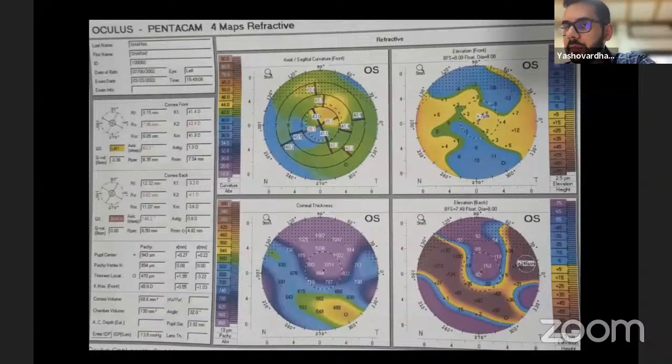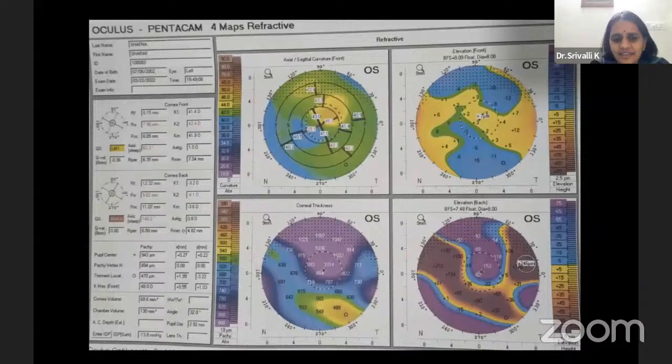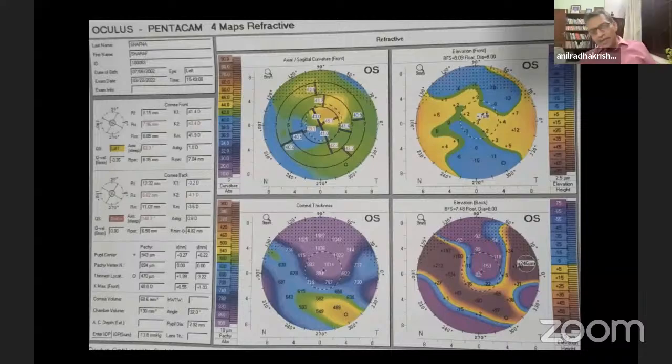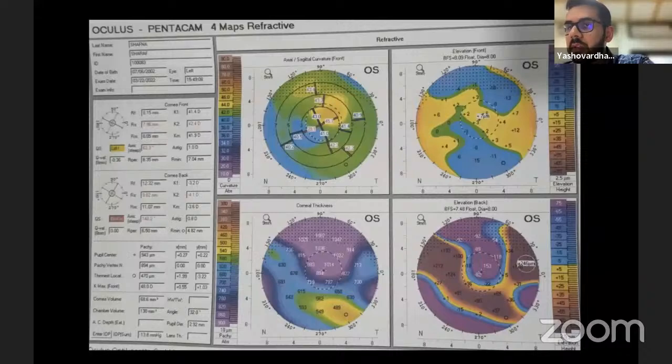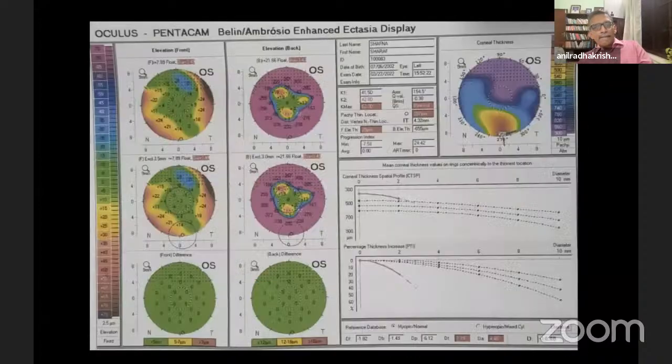Okay, can you see the cursor now? No, sir. Okay, fine. So the back curvature is very peculiar, no? See, in the upper part, what is the value? Upper part minus 92. Here it is plus and here it is minus. Okay, I'll go to the next picture here.